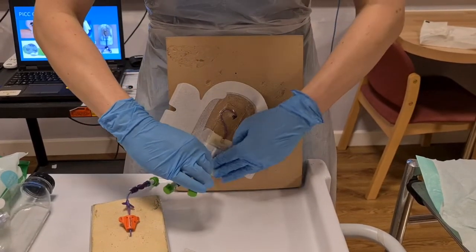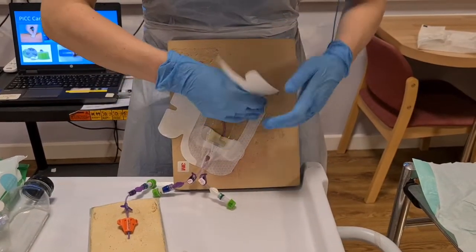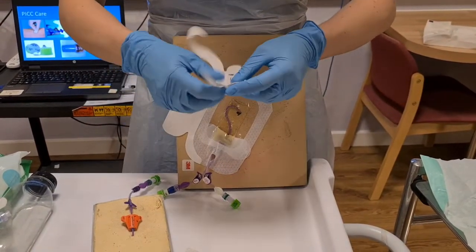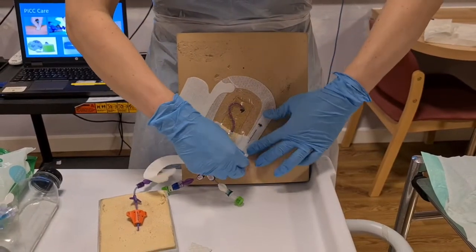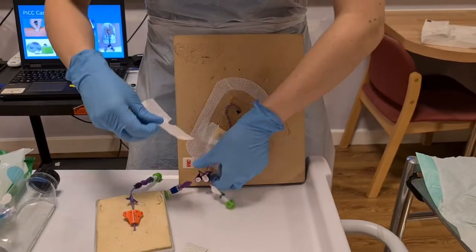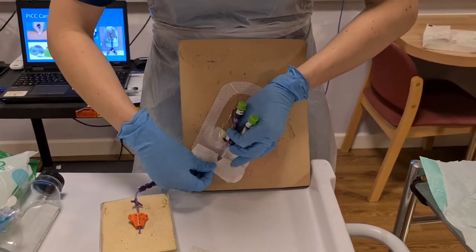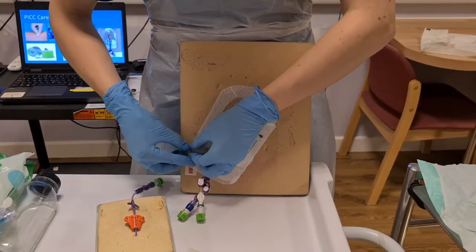Get your lumen out the other side. Go round, taking off the bit of paper. Stick it on and place the date of when the dressing was changed. And remove that and place underneath like so. Get bits of paper out.